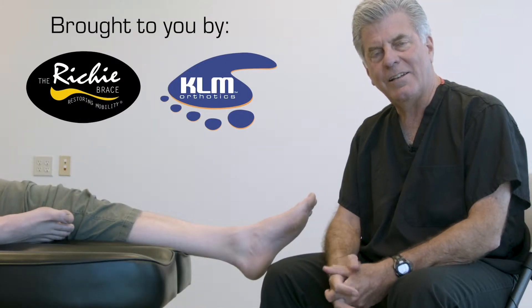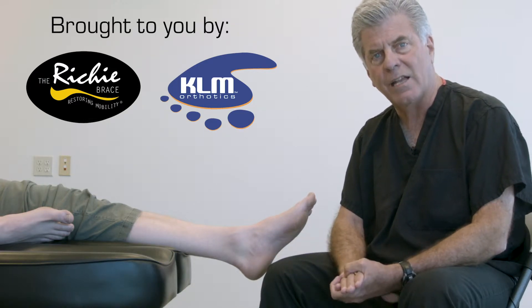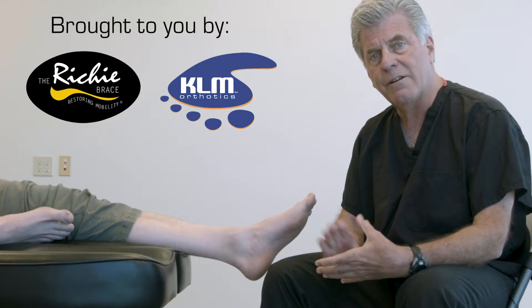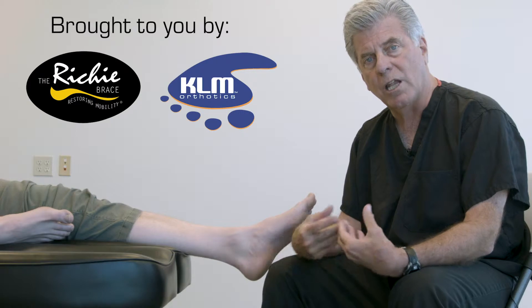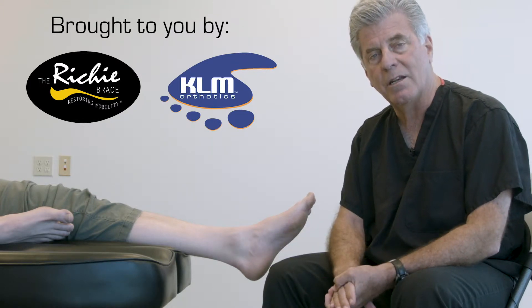Hi, I'm Dr. Doug Ritchie, and today I'd like to demonstrate for you the importance of positioning the foot for taking a cast or a scan for custom foot orthoses or for a custom Ritchie brace. I'm going to demonstrate how to find subtalar neutral and also the importance of loading or locking the mid-tarsal joint for stability of the foot. Ultimately, this translates to stability of the foot orthoses and stability of the brace so that we get an optimal patient treatment outcome.